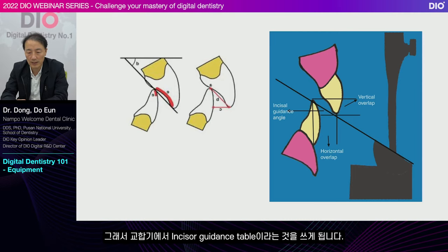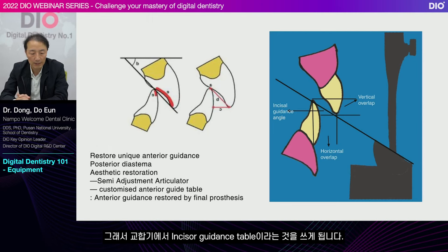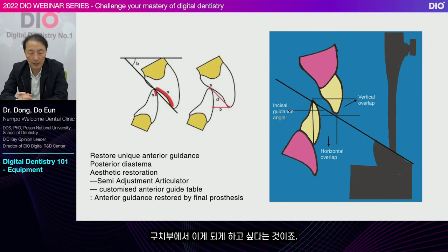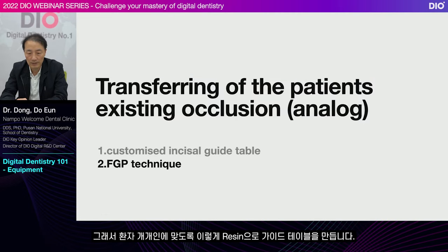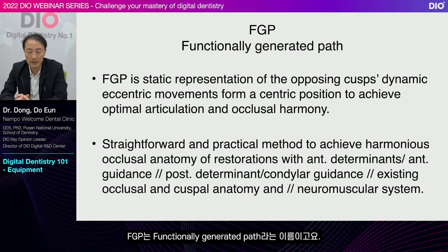So the articulator uses what is called an incisor guidance table. I want to make this happen in the posterior area. In that case, you need to use an articulator that is semi-adjustable or higher. So, we make a guide table with resin like this for each patient. And the other technique is called the FGP technique. FGP stands for functionally generated path.